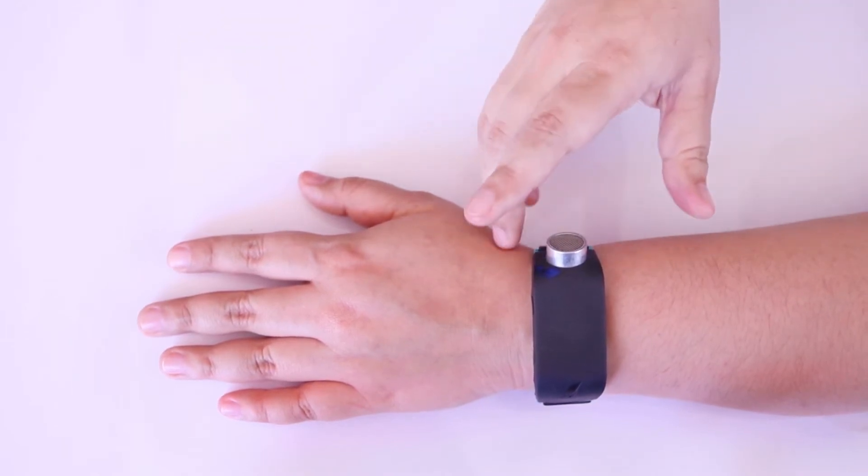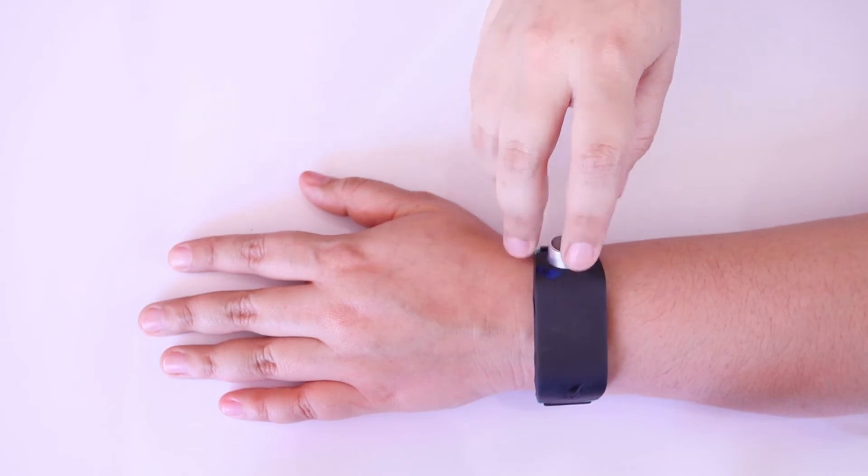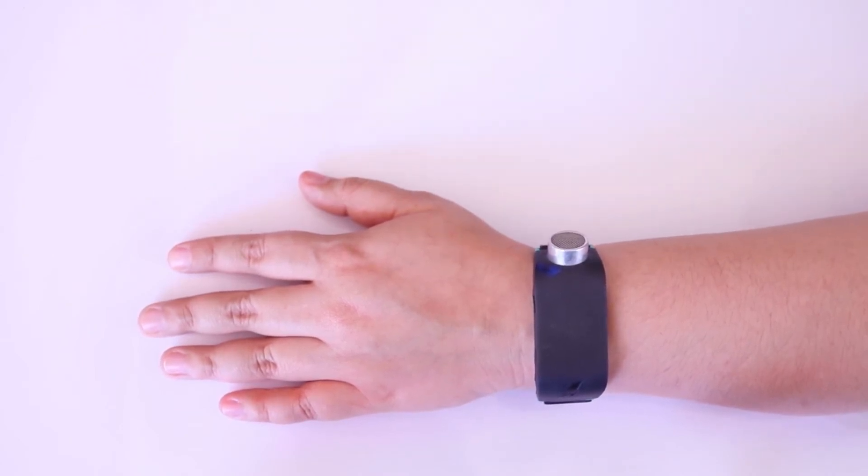Swipe in on the touchpad to read the hour. You will feel a series of pulses. Remember that a short pulse equals 1 hour and a long pulse equals 5 hours. For example, if it's 4 o'clock, you will feel 4 short pulses when you swipe in.